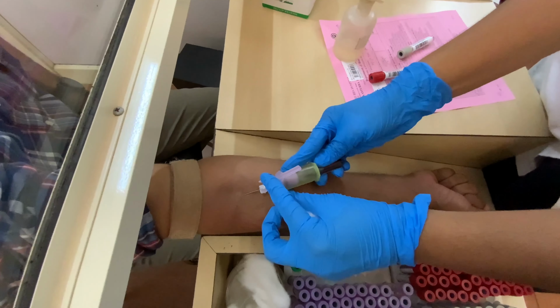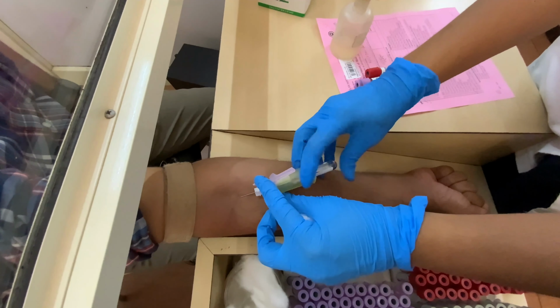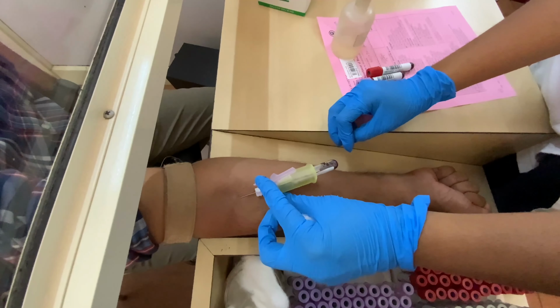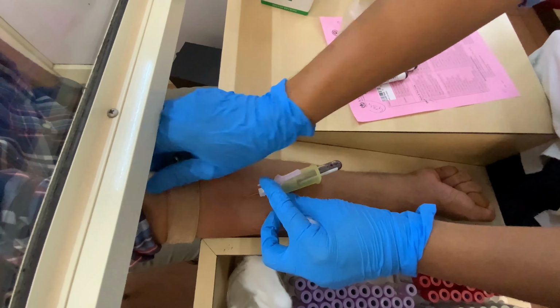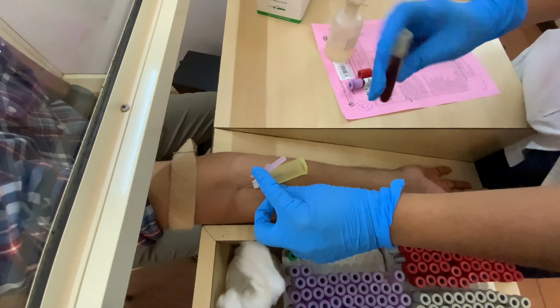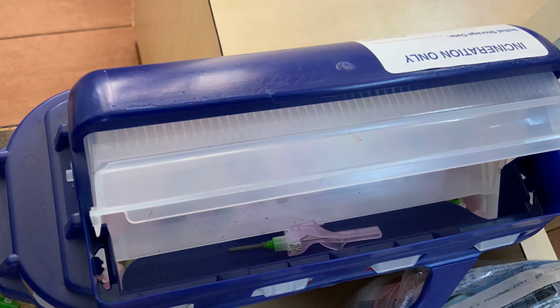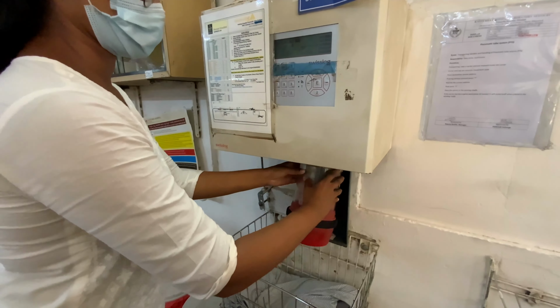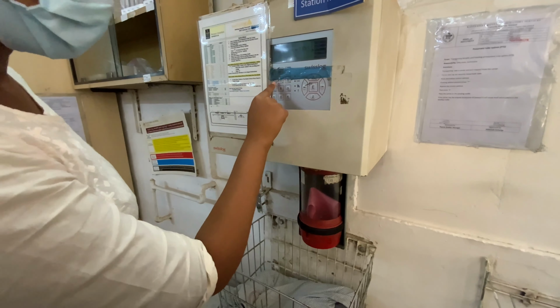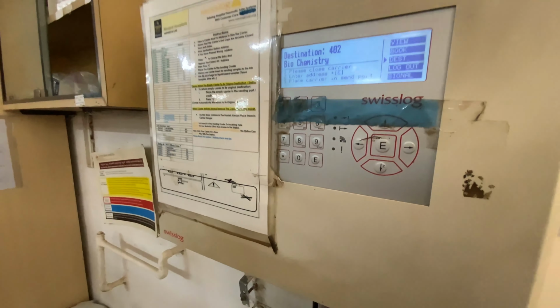Once the blood is drawn, the vacutainers are gently mixed to ensure proper mixing of the additive, which is usually an anticoagulant, with the blood collected. Used needles are discarded in a blue puncture proof container. The blood samples and the test request form are then transported from the sample collection center to the clinical laboratory via a pneumatic chute system.